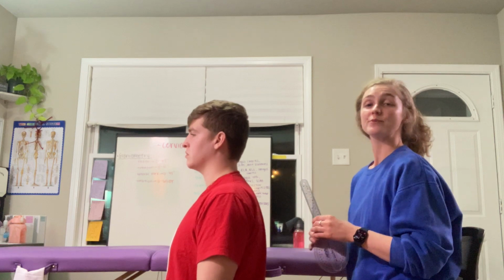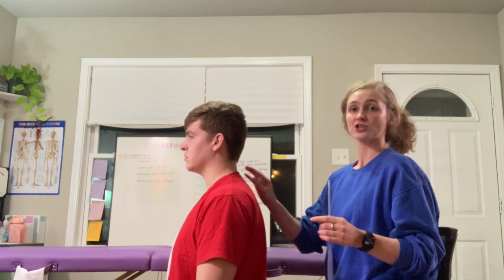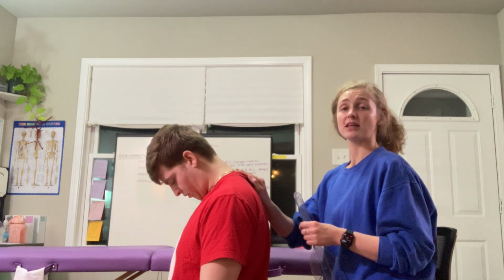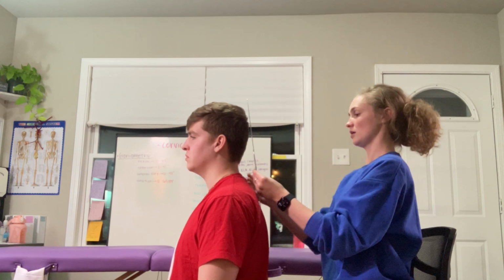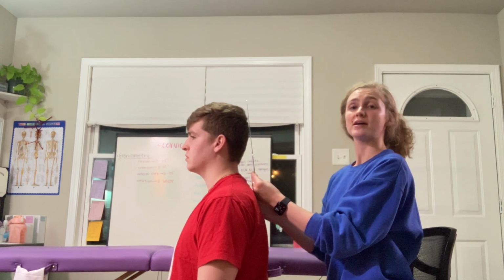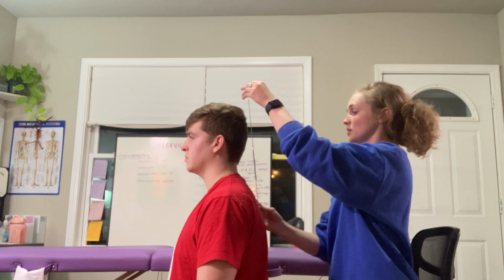Alrighty, so the landmarks that we're going to be finding right now for this is the C7 spinous process. If this is unable to be palpated just by visual eye, you can have the patient perform cervical flexion, and C7 will pop right out for you. So our fulcrum is going to be in line with C7. You can come back up. And then we are going to be having the moving arm in line with the midline of the skull, as well as the stationary arm perpendicular to the floor. Alrighty, whenever you are ready, we are going to be moving towards the left side.